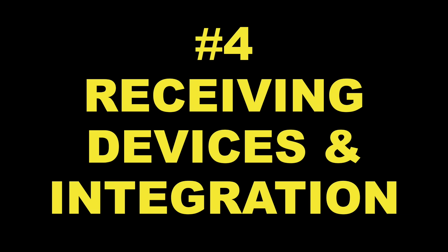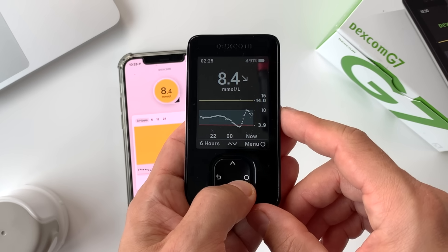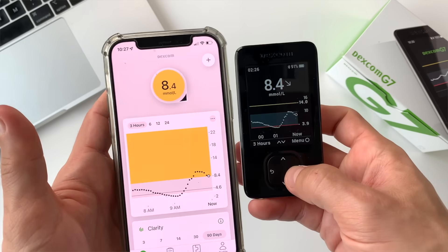Difference number four: receiving devices and integration. This is an important and often overlooked topic because different users like to view their data on different devices. What's really cool about the G7 is that it's designed to be paired with up to three devices — you can view your glucose information on the G7 phone app, on your G7 receiver, an insulin pump, or in the G7 watch app. However, right now the G7 only works with the Dexcom G7 app and the receiver. It doesn't integrate with any insulin pumps and doesn't send data directly to Apple Watch just yet, though this should happen in the future. For Freestyle Libre 3, there is no receiver.